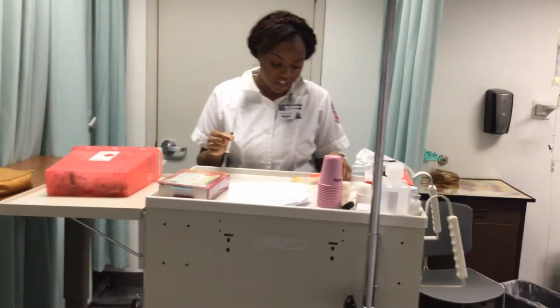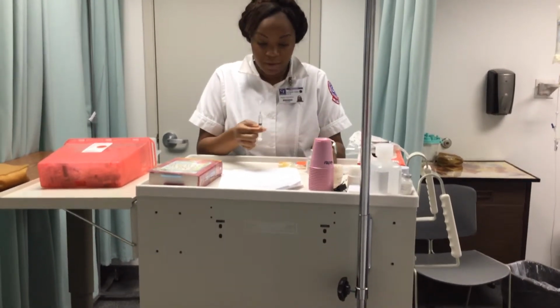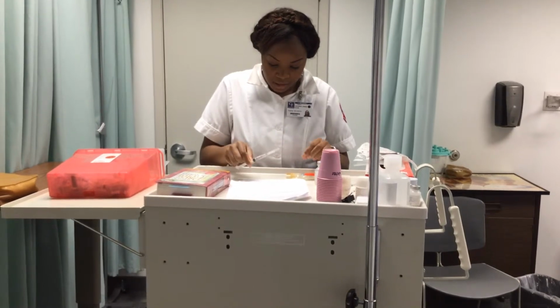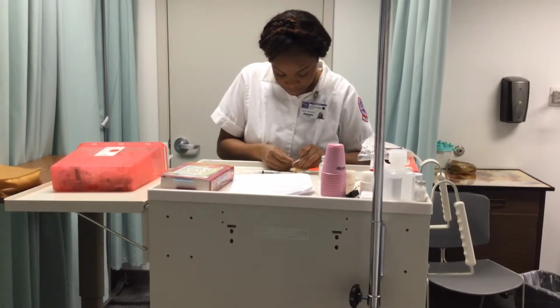I'm going to do my second medication check. I have my gentamicin, which is the 2 mLs that I just withdrew. I'm going to compare with my MAR. Should have taken 2 mLs, and I have 2 mLs. And I'm going to go ahead and add it to my medication.